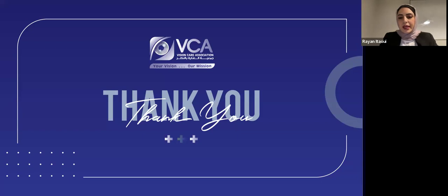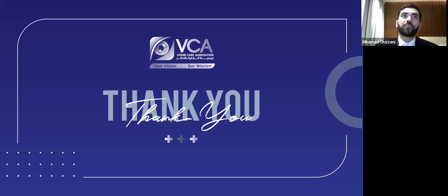Another question from Layla. Is there usually a need to re-operate this procedure, or are the results usually successful with only one operation? Okay. Usually, when we perform cross-linking, we do it once in life.